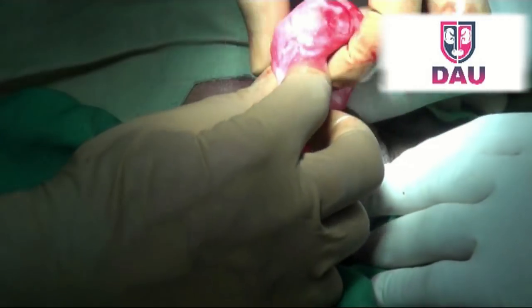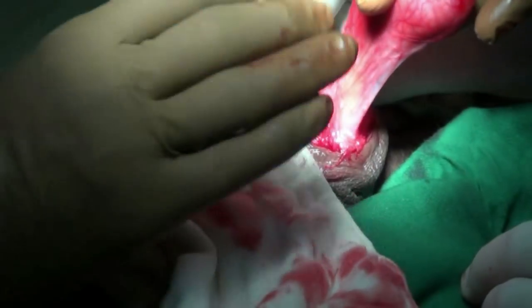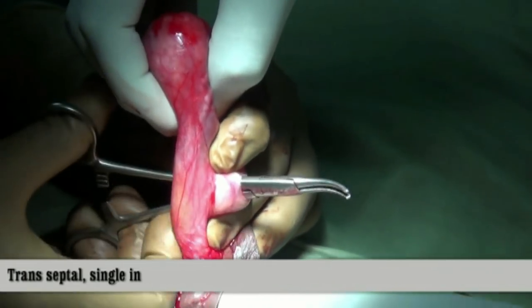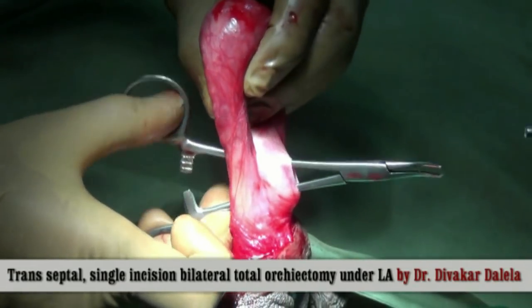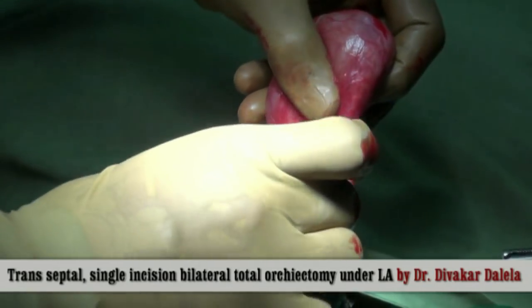That is how the testes is delivered out. From all sides of the spermatic cord, retract the fibers of the dartos properly. So this is the testis delivered out with the spermatic cord attachment. With the hemostat forcep, push it in between to divide this into two equal halves. Open the blades to separate — now this spermatic cord is divided into two halves, as you can see.